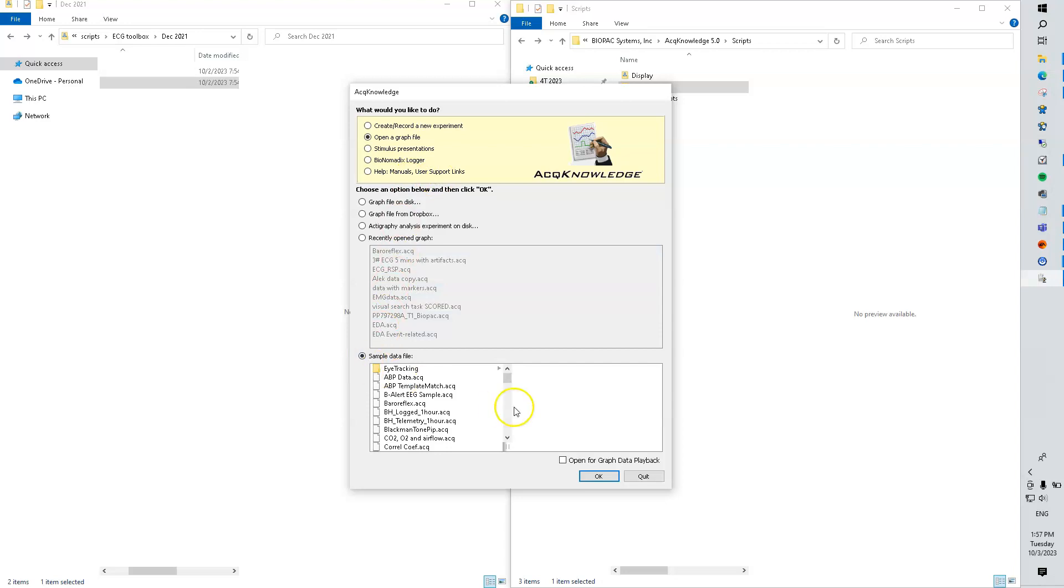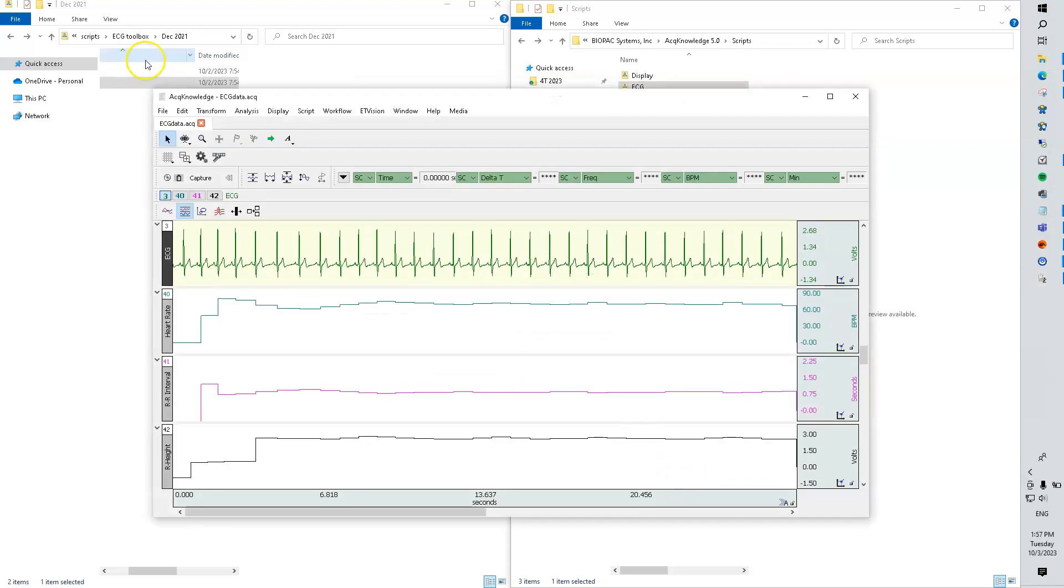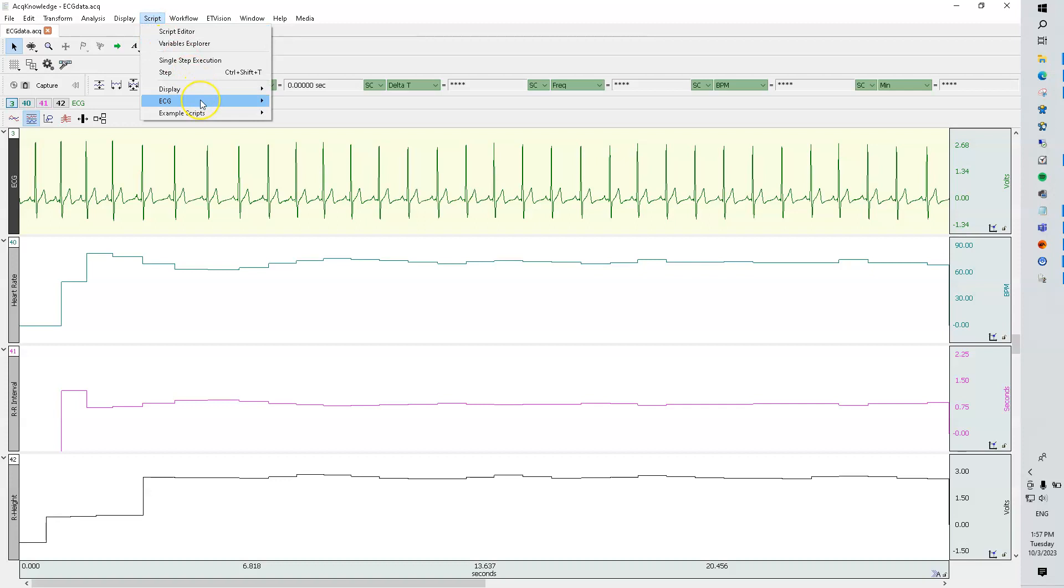We'll go ahead and open up the data file here, just ECG. Now we can see the scripts.